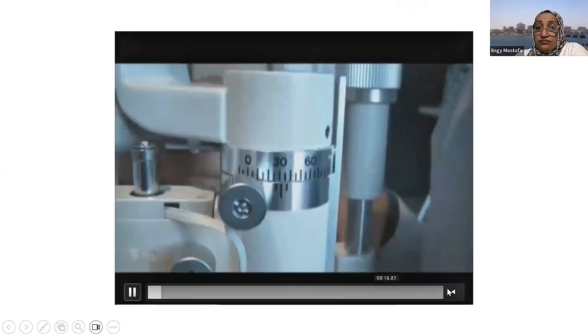So what we are looking for is the guttata, of course. The guttata are the irregularities in the endothelial surface. So why is this important? Because the endothelium is irregular. So why don't we send them only for specular microscopy if you don't have it in your locality? Actually it is because it heightens your clinical skills and gives you a prognosis idea, as we said previously. Of course, the specular microscopy would add numbers to your vision, but at least a good physician would have an idea even before sending the patient.